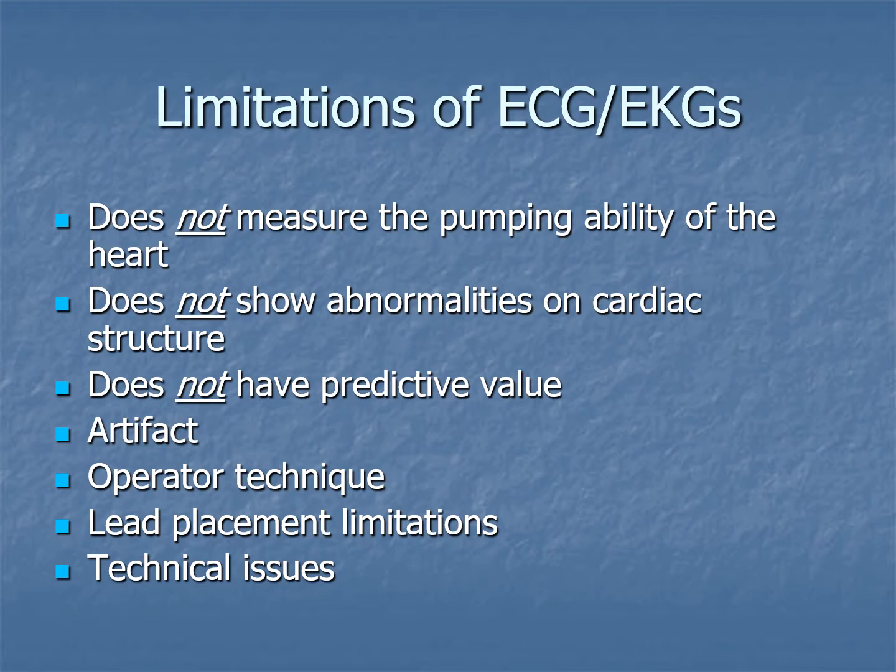Some issue with a wire, a lead, something along those lines. Operator technique. So just like most of the things that we do in healthcare, whether you're a nurse or a respiratory therapist, again, technique is a lot. There's no substitute for experience and becoming proficient with various diagnostic and therapeutic techniques. Lead placement limitations, other technical issues just related to the clinician, related to the equipment and things along those lines.